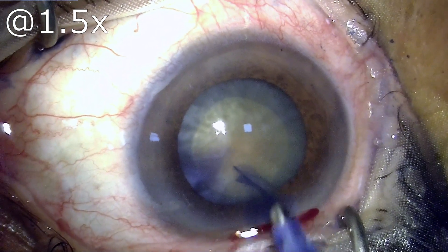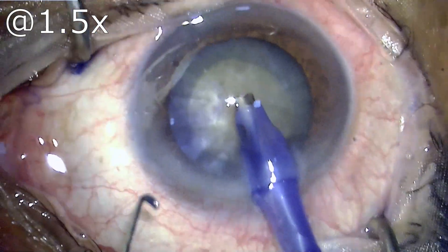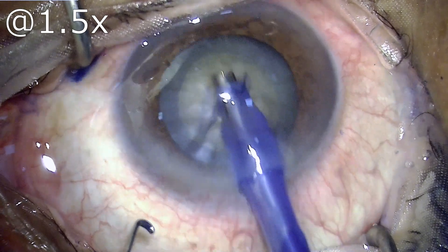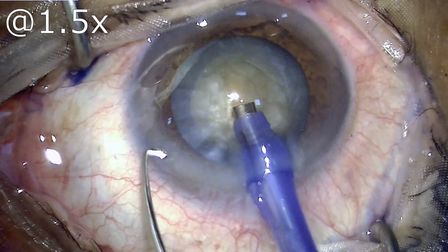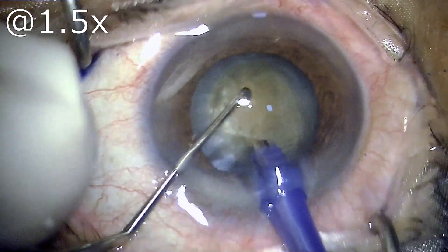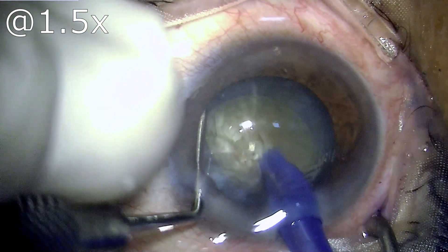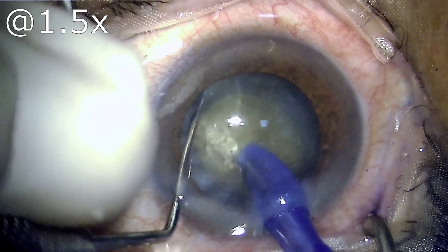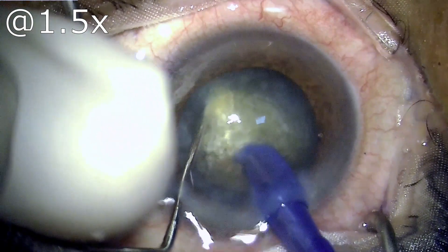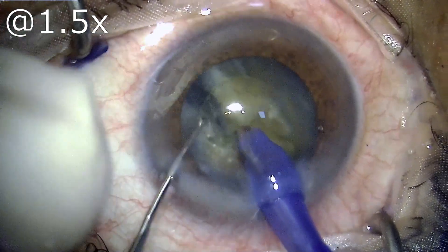If the pieces are chopped into just four and then emulsification is attempted, then invariably these pieces will prolapse out of the bag — if not totally, then at least one part of the nucleus chunk is definitely going to prolapse out of the bag.